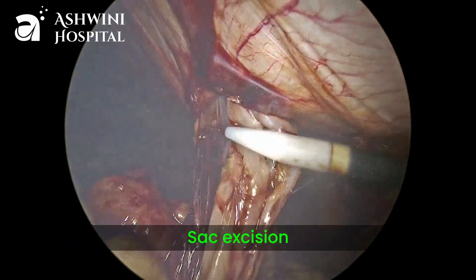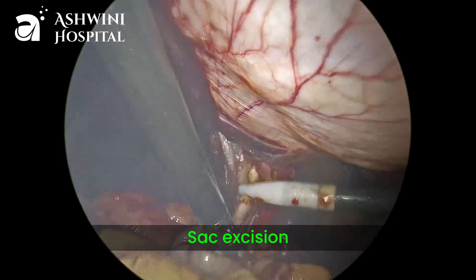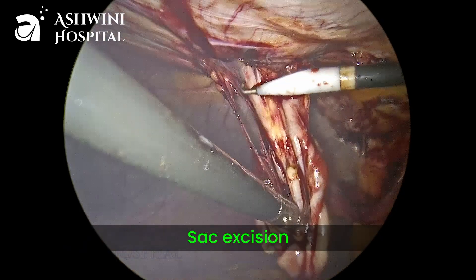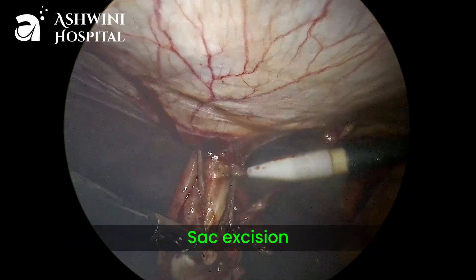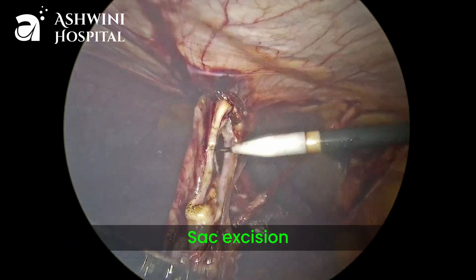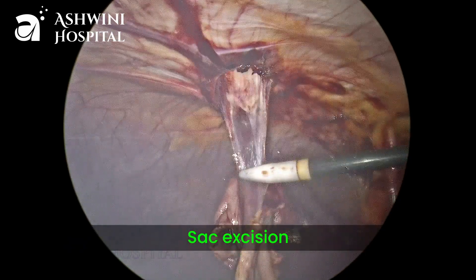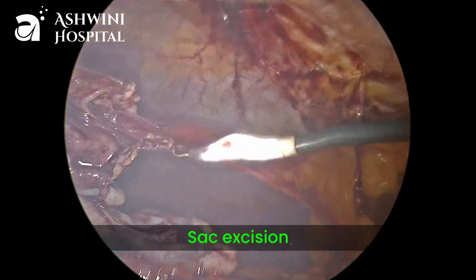At this point there are high chances of injury to the skin because of excessive traction. We should be cautious not to injure the skin. Now slowly the sac is coming out and you can see the sac is completely excised.